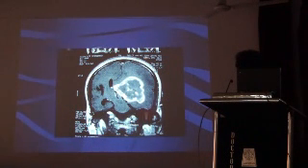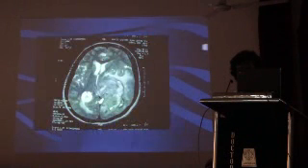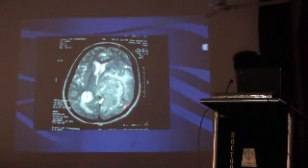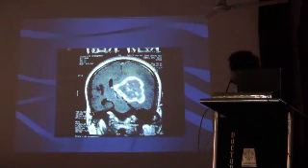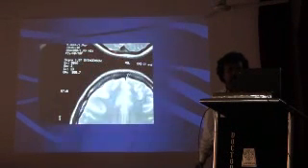Again, same patient with contrast, the tumor outline is beautifully delineated. If you look at this one, see, the surrounding edema is suppressed. This is surrounding edema, the tumor, exact delineation of the tumor is possible after giving contrast. Okay? And the nature of the tumor, what is inside, etc.